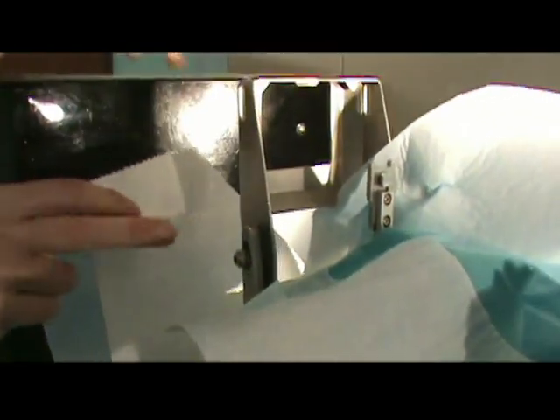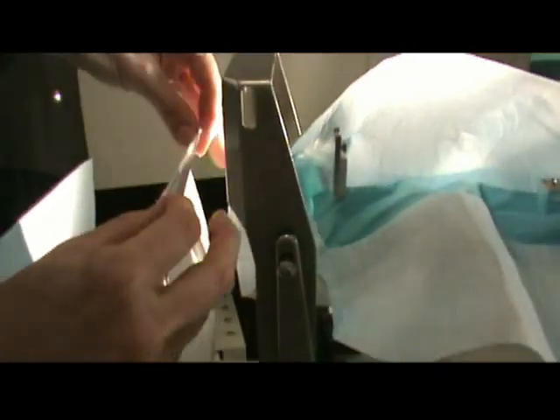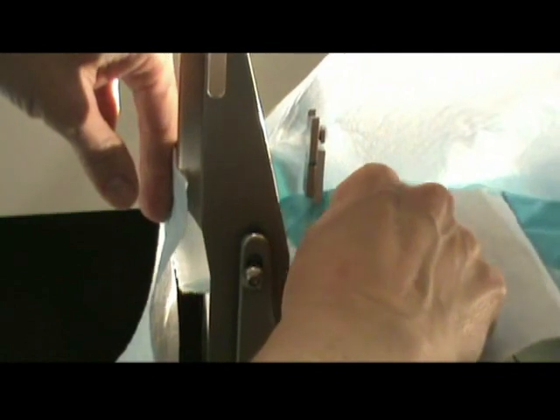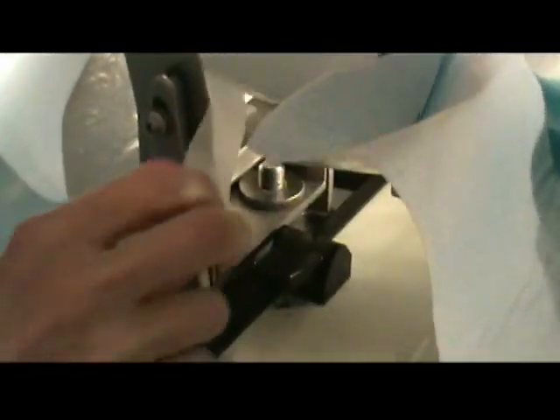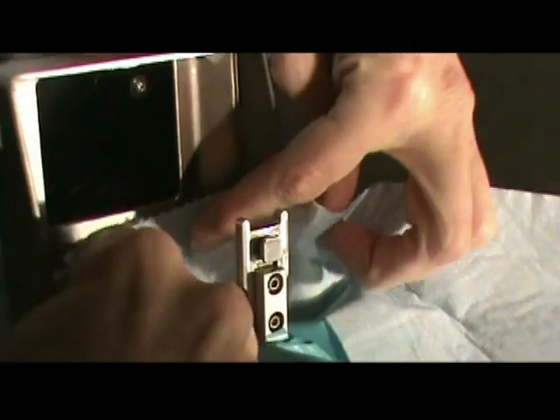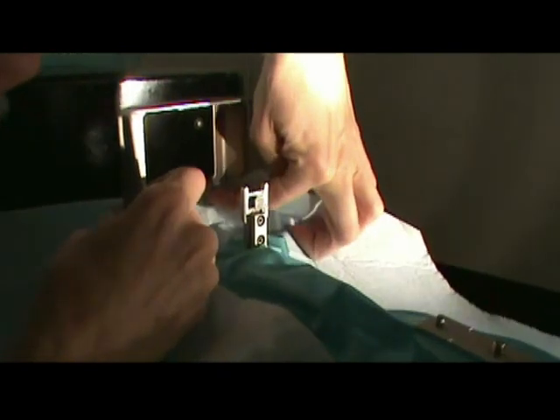If you take that adhesive tab off, you can adhere it to the front of the biopsy pad so any fluid catches right here. The other piece also has a sticky and we're going to adhere that to the inside of the paddle so it goes right underneath there.